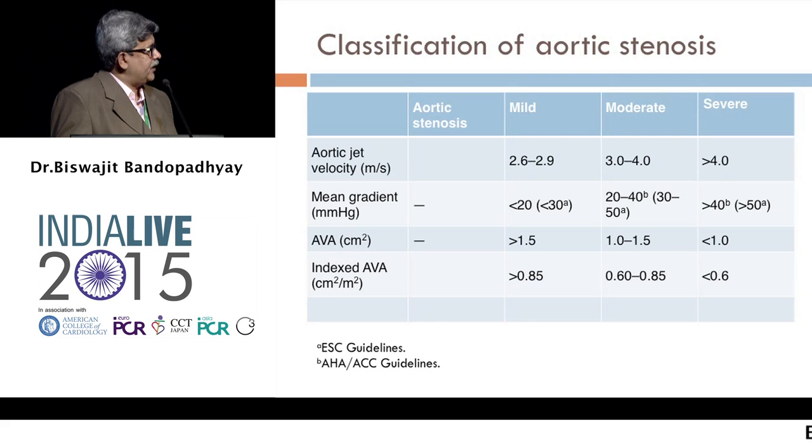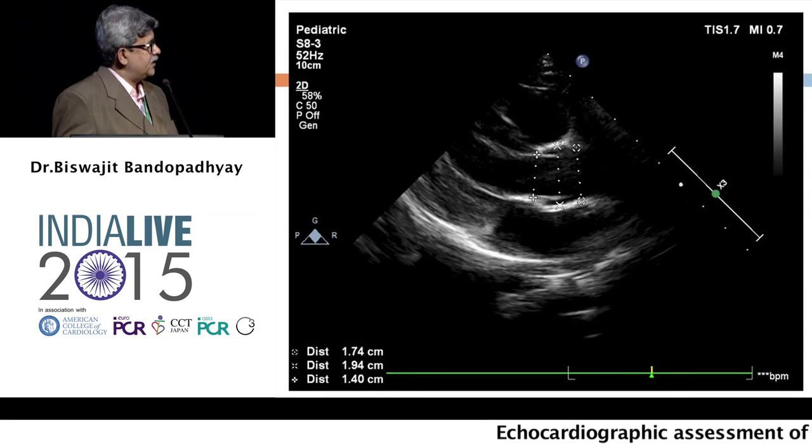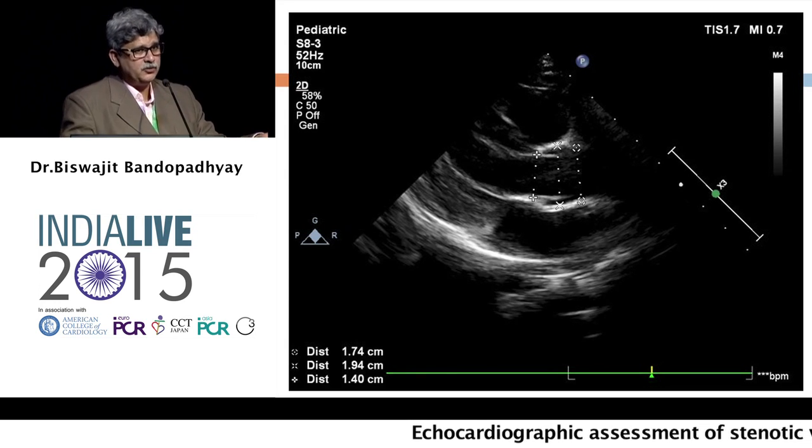You have to measure the valve annulus in different views, and no single view will give you the right answer. So there you measure the valve, the root, and the sinotubular junction. When you are measuring from hinge to hinge, please do not look at what is being measured. That will bias you. Just measure from hinge to hinge, in multiple views, and then get a final assessment of what size balloon we are going to use.